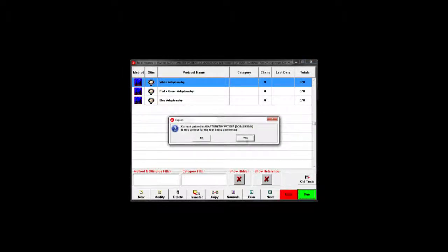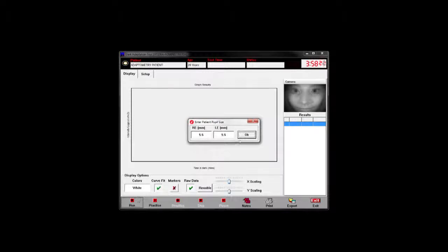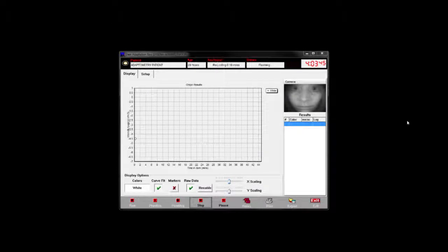When you're ready to begin the test press the run button. After a set bleaching period the patient is exposed to a series of flashes at short intervals and asked to press the button when they detect a flash. The dimmest intensity reported seen during one of those short sequences is used as a marker in the graph.